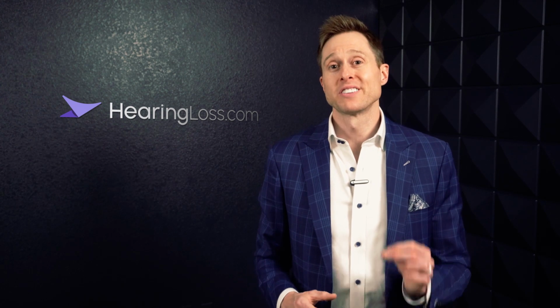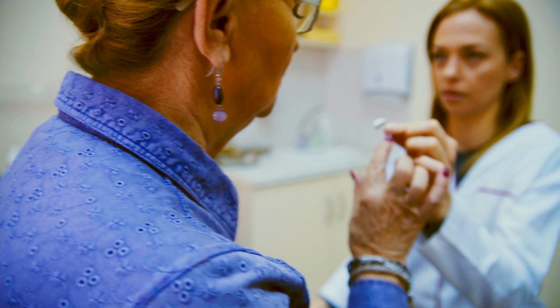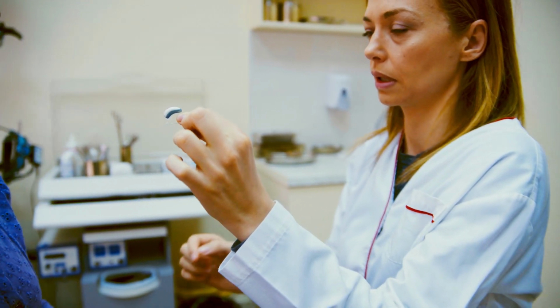Most prescription hearing aids will have anywhere between 3 and 5 different technology levels. The higher the level, the more features and customizations your hearing care professional will have access to customize the programming of your prescription devices. Of course, the higher the technology level, the more the devices will cost. Which level of technology is most appropriate for you is a conversation you should have with your hearing care professional.